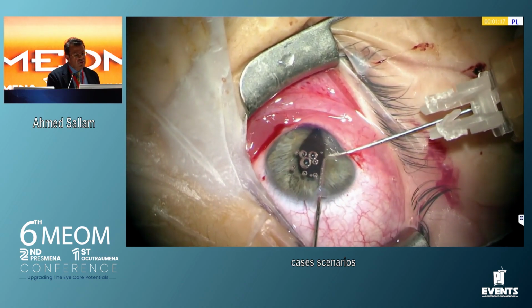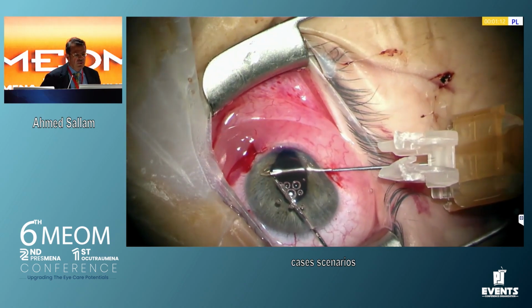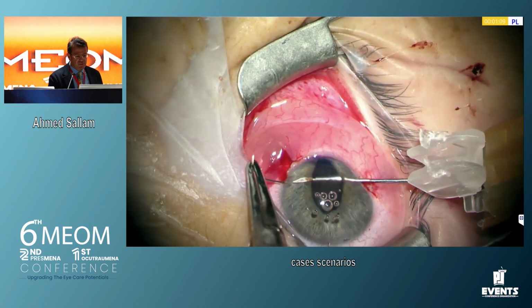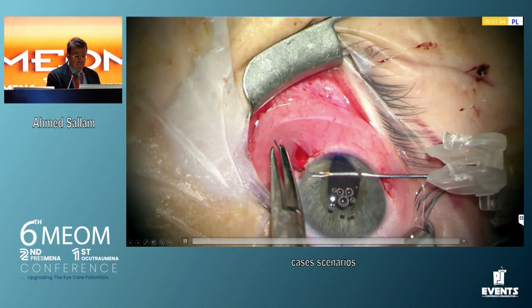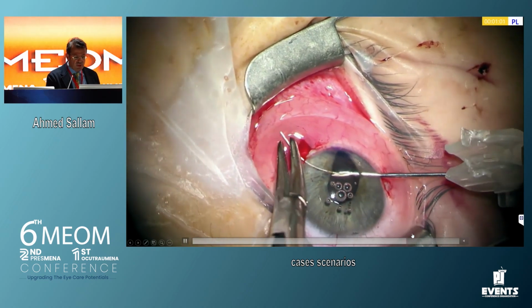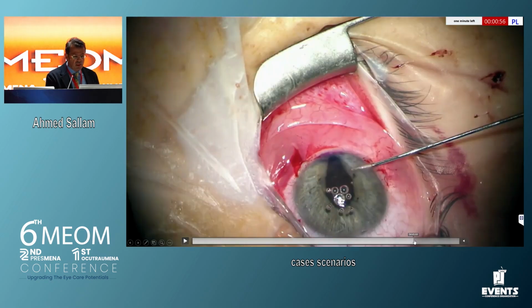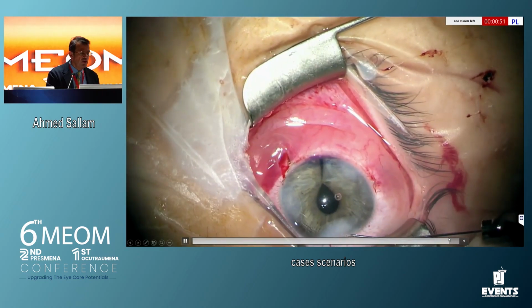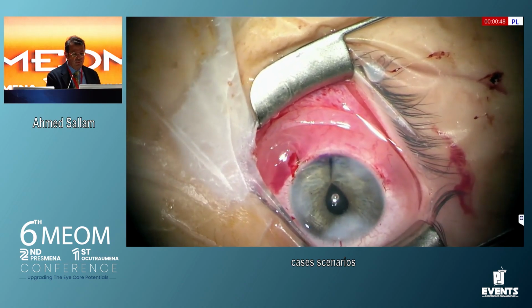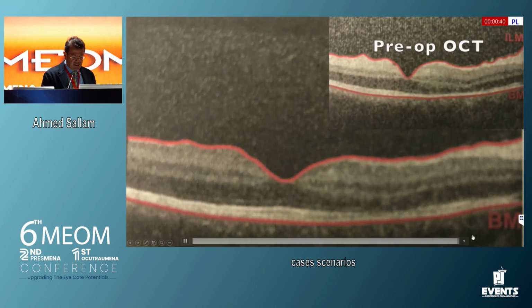And again, usually you don't need to make it that complex, and you can just get it with the needle with the help of a cannula to support the iris. But here the issue is he's phakic, so that's why we did a bit more meticulous here. And then putting the needle here, and similar to what Ashraf showed before. And then out, and then we do the Sipser knots repair, which again simplified the technique so much. And then hydrating the wound. And the patient did fantastic, and the fistula closed and his pressure went up nicely.